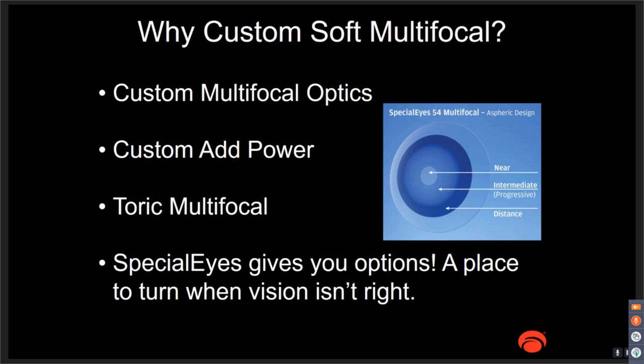The custom multifocals, again, you can alter anything you want. If you want to do near in the center, intermediate, distance, or distance in the center, intermediate and near, you can do that. You can put a near center in one eye, a distance center in the other eye. You can flip them however you want. It's really kind of WW: whatever works and is successful for that patient.